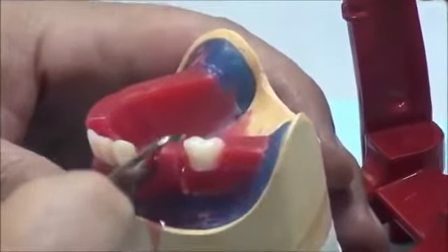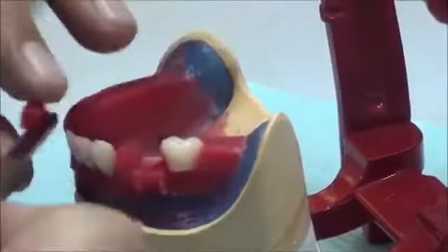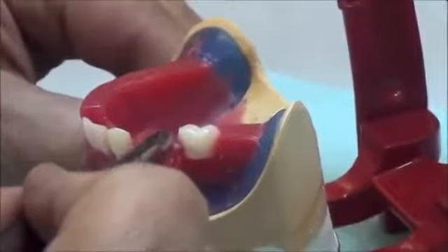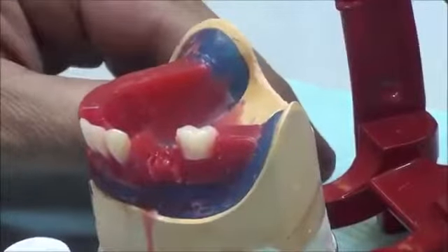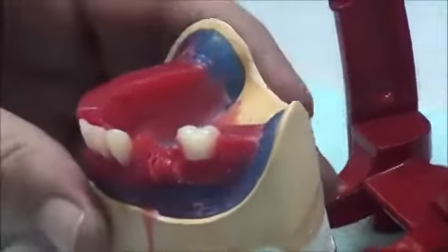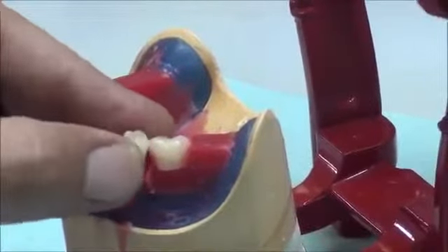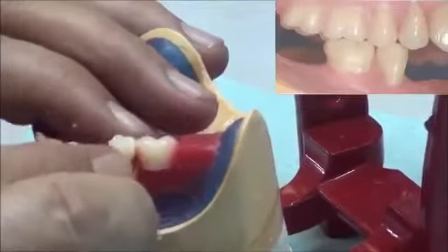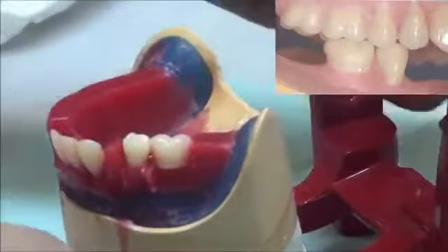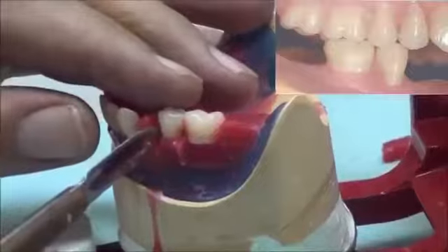They're equally the same. And notice that now after we have set tooth number 6, the wax that we are removing now is some space for tooth number 5. But before we removed it, the upper premolar was touching on this wax. So each time before I remove any wax, make sure it's still touching. Tooth number 5 will interdigitate with upper tooth number 5. So we put it into location.